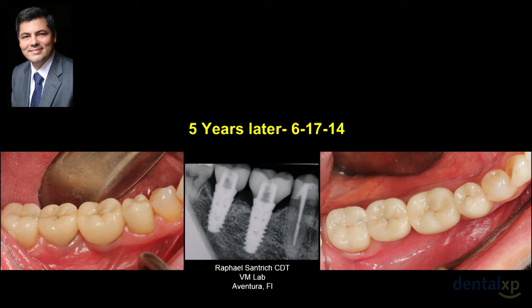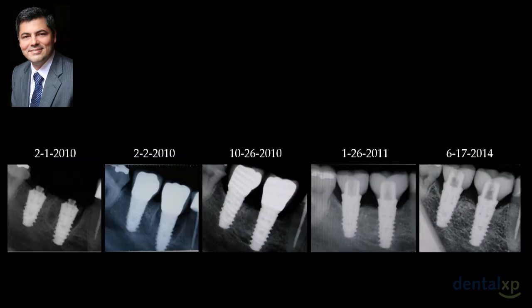So the answer to the question, do we deliver permanent crowns when we have incisions or flaps, the answer would be no, because if you do that, you're going to need 2 sets of crowns, and you're going to put the whole area in danger. So if you want to spend some time and spend some money in doing 2 sets of crowns, then that's a possibility. You're going to have beautiful temporary crowns made in ceramic. But when you're working with the tissue punch technique, yes, definitely, there is a possibility of delivering ceramic crowns.